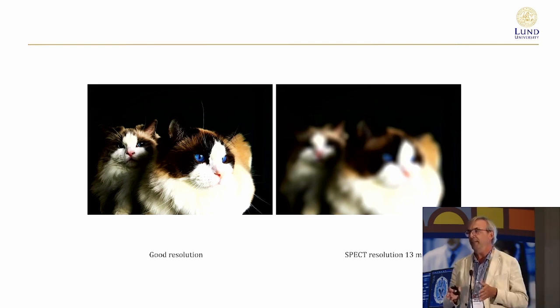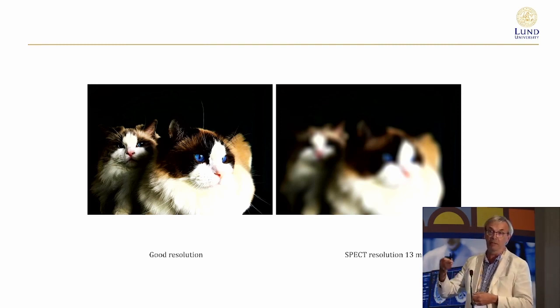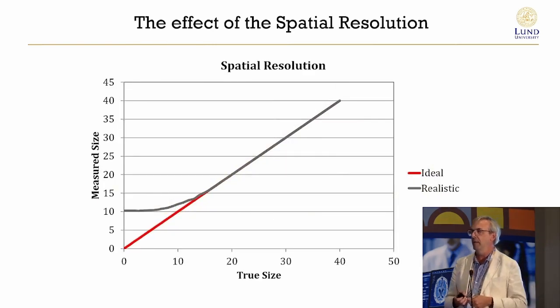So what you see is not the truth. And that is a hard fact of all our images. It's not what we see that is correct, because we have a blurred image caused by the spatial resolution. So we need to have that always in your mind, that there is a blurring effect.